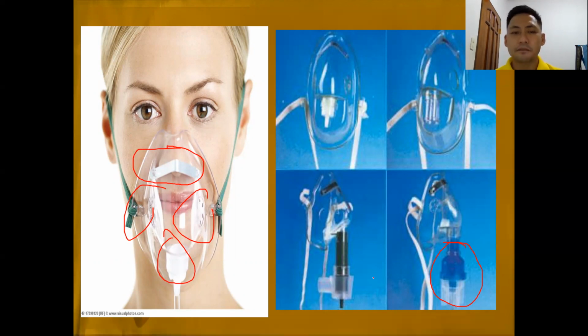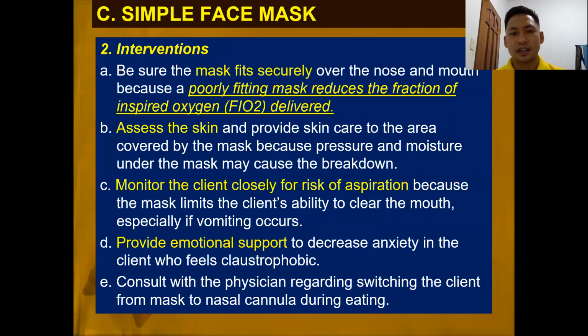Preventing spaces that would allow air to come out from the face mask and affect, of course, the FiO2 being administered to your patient. So make sure that you always adjust the nasal area of the face mask.